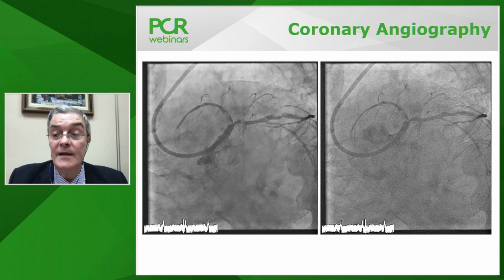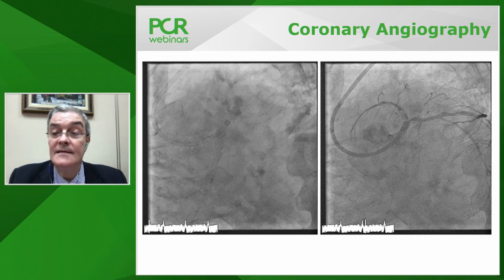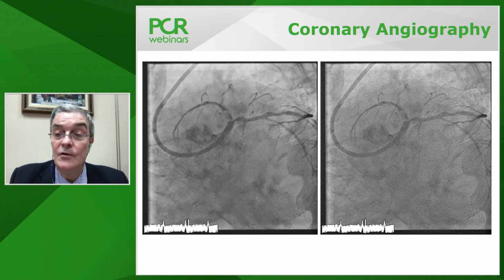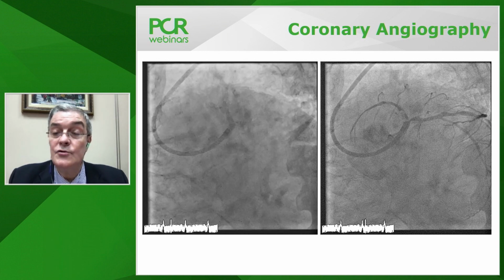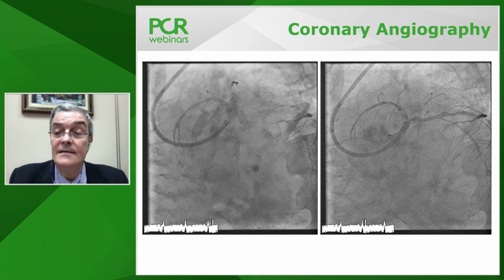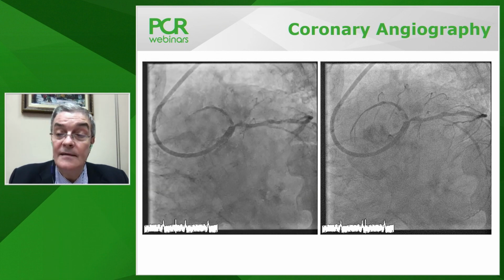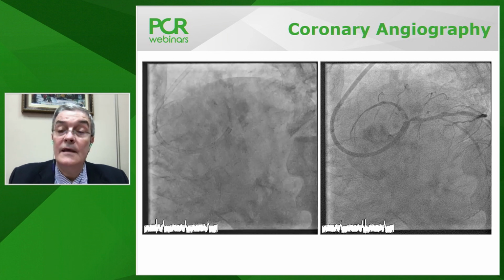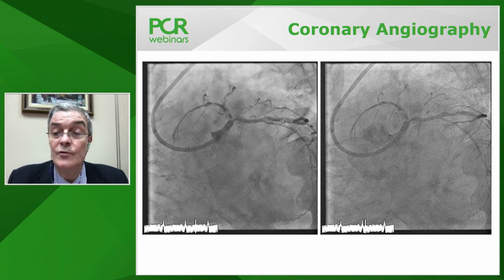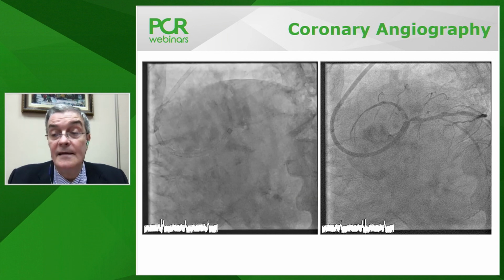If we are able to really cross the very distal cell, when we inflate the balloon, we push some struts and scaffold partially the ostium and create a favorable configuration at the ostium of the circ. That is actually mandatory in order to position the stent in the circ with minimal protrusion. But as you said, we have three options: T, TAP, or culotte. In case of culotte, it will be a mini culotte with minimal protrusion and minimal overlap in the proximal part of the vessel inside the left main.